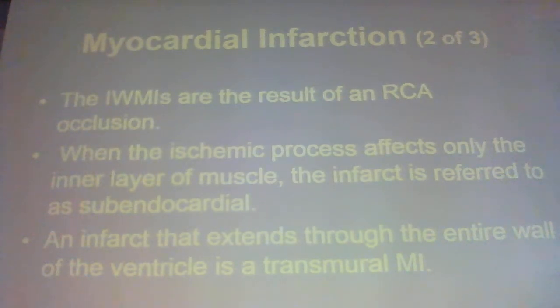Okay? How many of you have seen your 12 lead spit out and say, MI suspected, age undetermined? That's what it's picking up. Pathological Q waves in a pattern. 2, 3 and F, V1 and 2, V3 and 4, 1 and L, whatever the pattern is. Right? Just like an MI. It says age undetermined because you don't know if it is 2 hours old or 20 years old. Once you have pathological Q waves, you always have them for your whole life. There's no way to tell without other EKGs to compare it to. That makes sense to everybody?